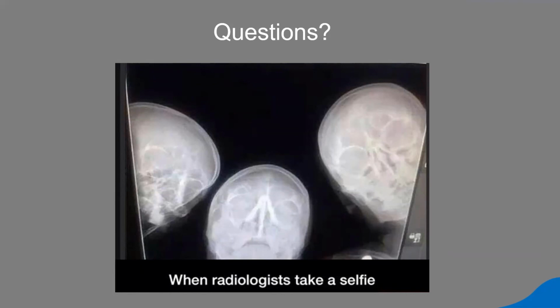All right, we're going to do 2 more questions. Number 1, if an office takes a CBCT, does it make that doctor responsible for any conditions missed? And then along with that, should most offices send CBCTs out to be evaluated by a radiologist?